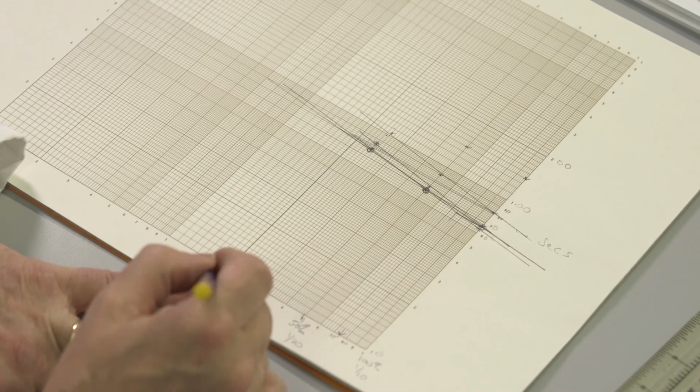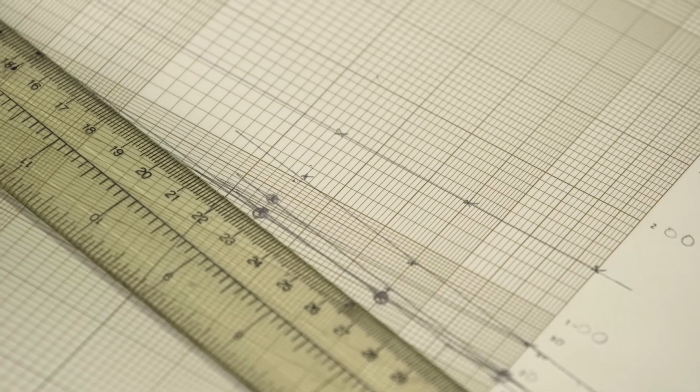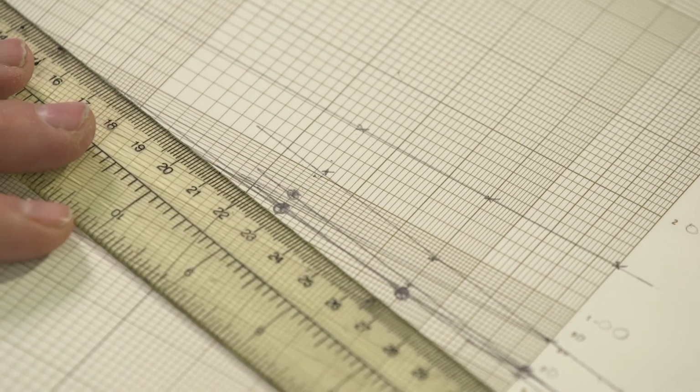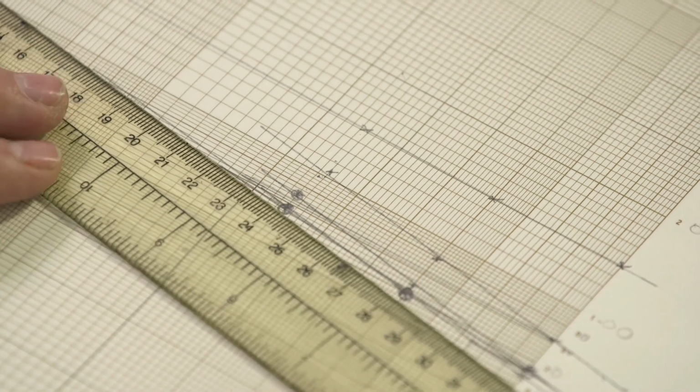The 1 in 40 dilution, 142 seconds. First question, is it a straight line? Actually, it's a pretty straight line. Is it parallel to the standard? Absolutely not. There's no differentiation in clotting times at the 3 different dilutions. And now we have a problem.